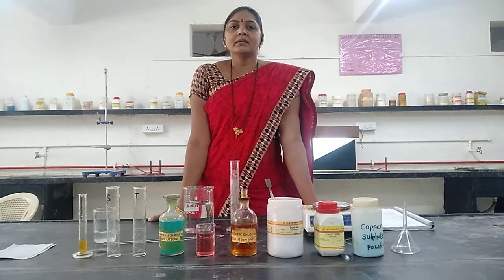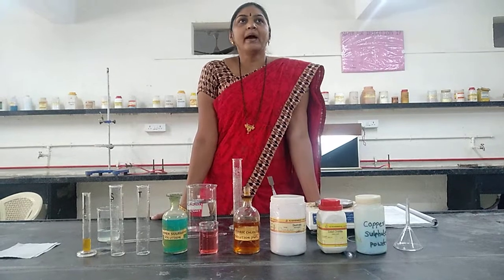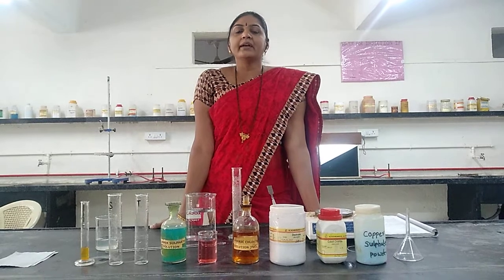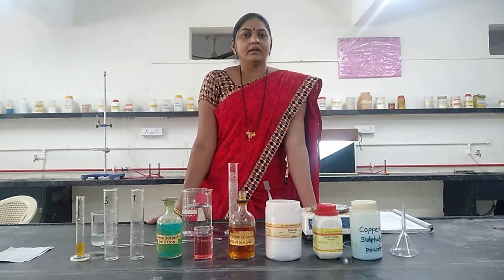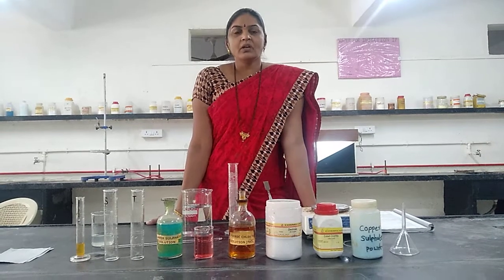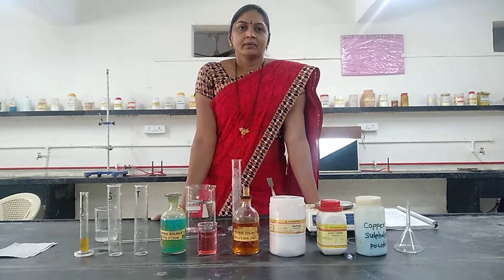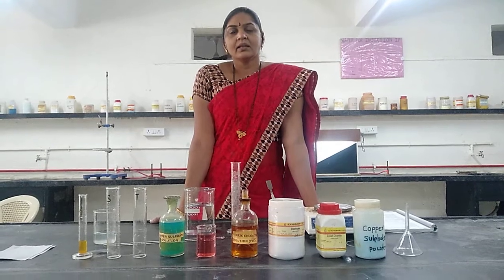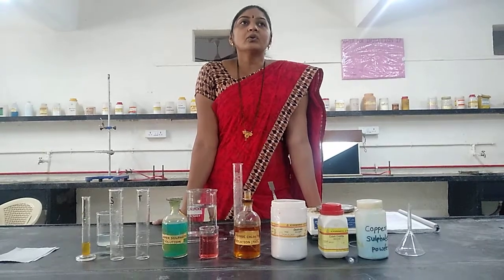Color, that is when radiant energy in the range of 400 nanometer to 700 nanometer is shown to the observer, that is perception of color, that is known as color of that particular solution. What is achromicity? Achromicity means colorless. Like water is colorless, a watery solution observed like that is known as achromicity.